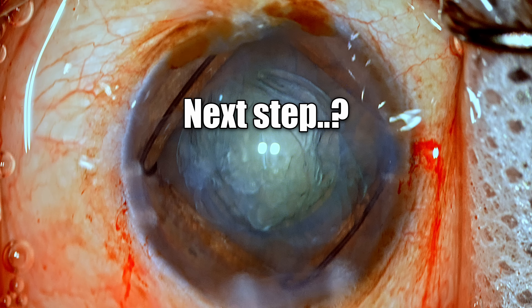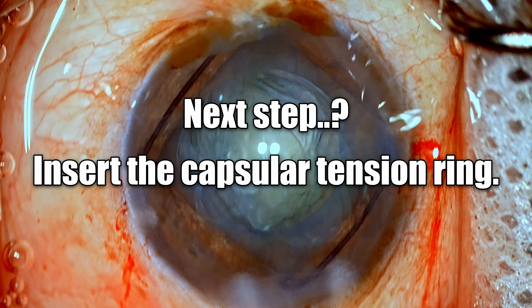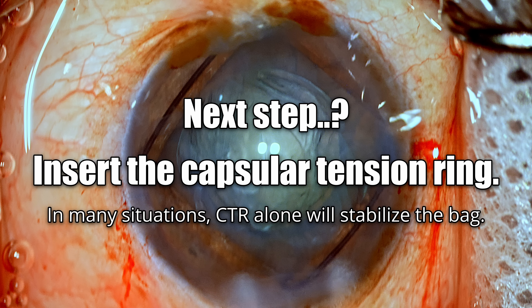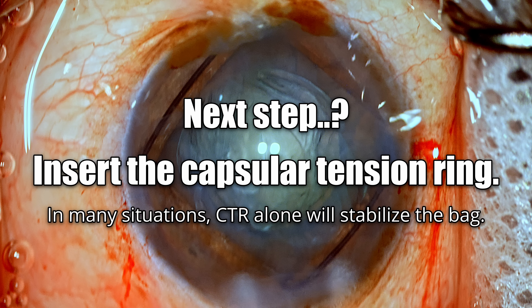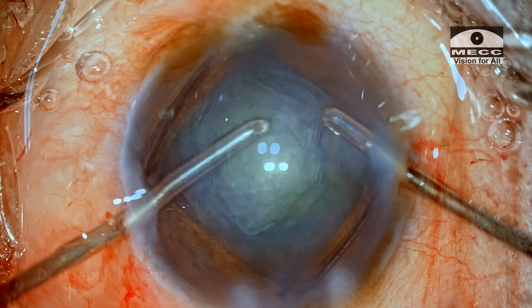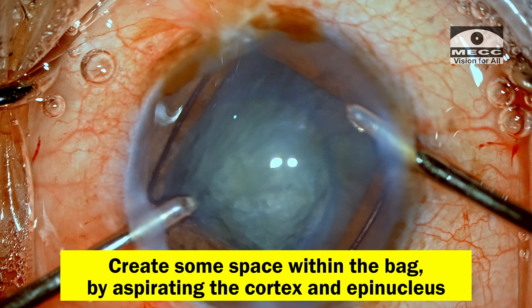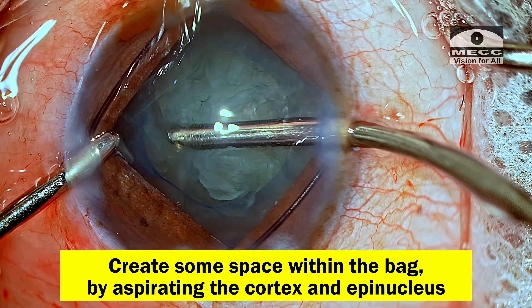The next step for me is to implant the CTR now itself. I always prefer to implant the CTR first before venturing into the capsular hooks. The simple reason is that in many situations I can just fixate the bag with the CTR itself — I don't need to make four or five additional ports to use the capsular hooks. If it doesn't work out, then obviously capsular hooks can always be used. To put the CTR in first, I need to create some space within the capsular bag by aspirating some of the overlying soft lens matter like the epinucleus and cortex using my bimanual irrigation.